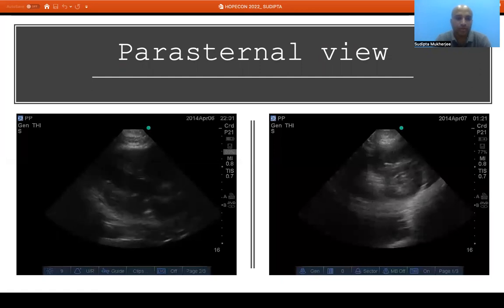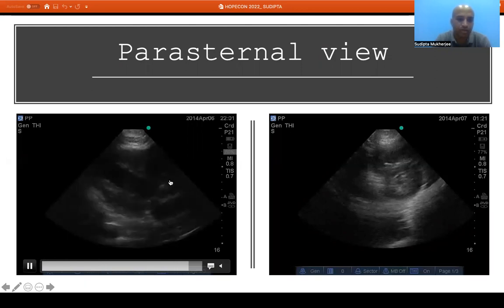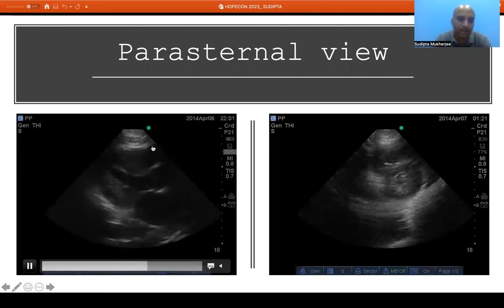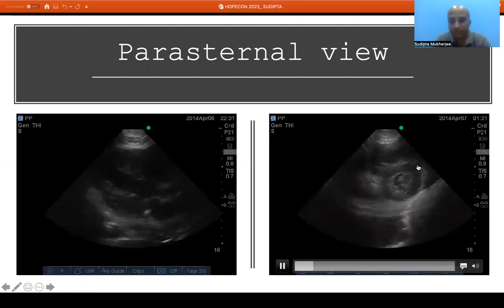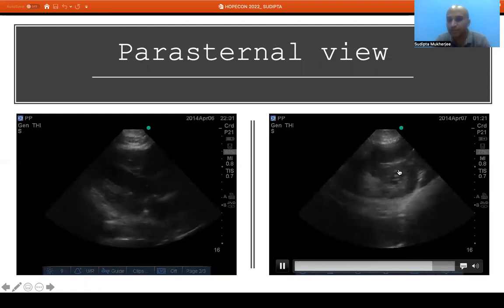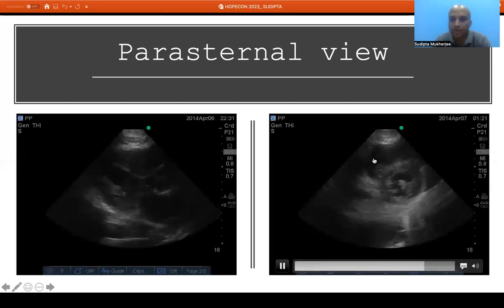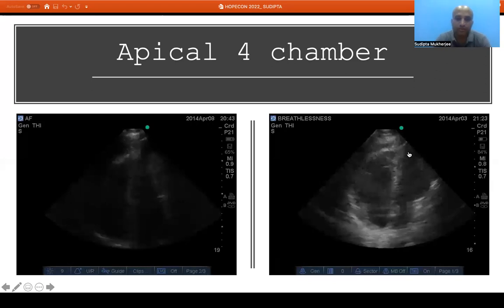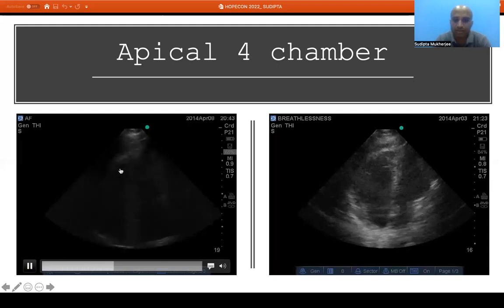In the parasternal long axis view we can see the left atrium opening into the left ventricle, and the left ventricle emptying into the left ventricular outflow tract, as well as the right ventricle. In the parasternal short axis view at the papillary muscle level, we can see the thick left ventricular muscle band, differentiate left from right ventricle, and see the right ventricle as an ellipsoid crescent. In the apical four-chamber view we see left atrium, left ventricle, right atrium, and right ventricle.